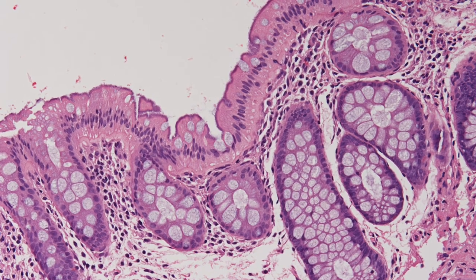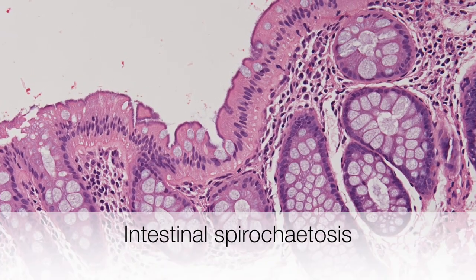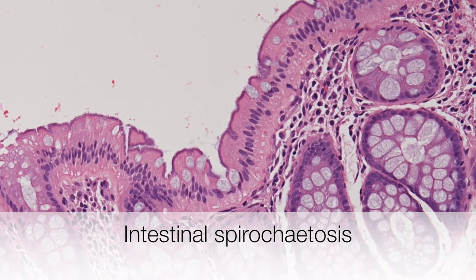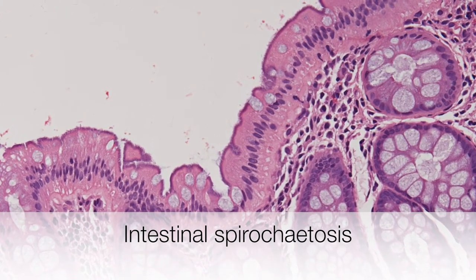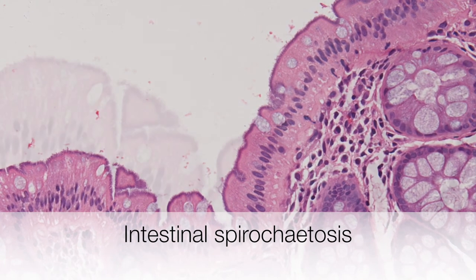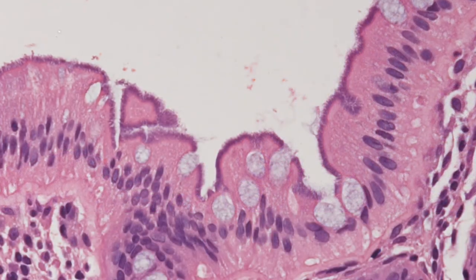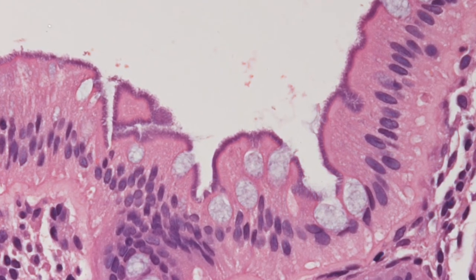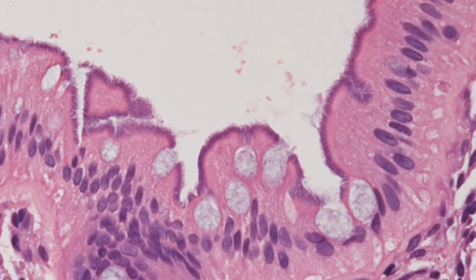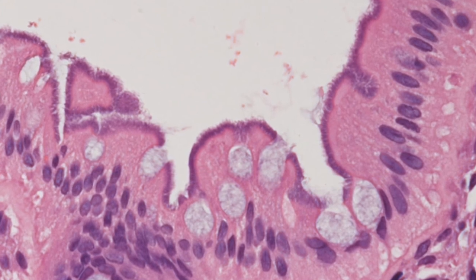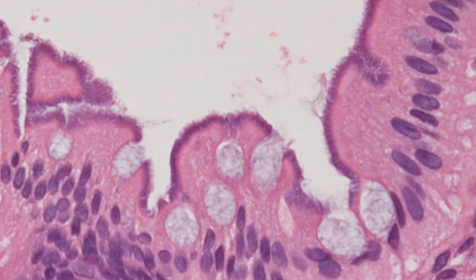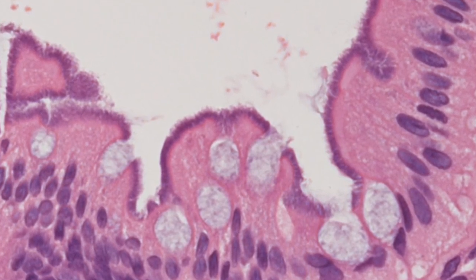This is the H&E of the colonic mucosa. The crypts appear pretty much normal. There's no obvious inflammation. But you can see a thin blue line on the surface of the mucosa. And on higher power, the blue line has a rather fuzzy appearance, and that is because the mucosa is teeming with spirochetes that are standing on their heads parallel to the microvilli, producing a sort of shag pile carpet appearance.